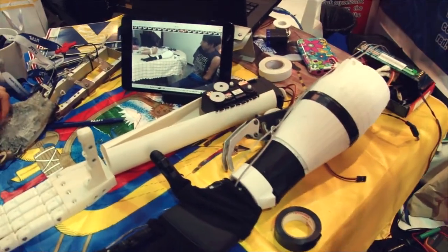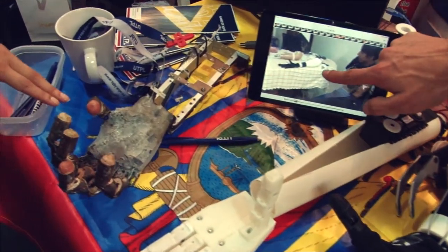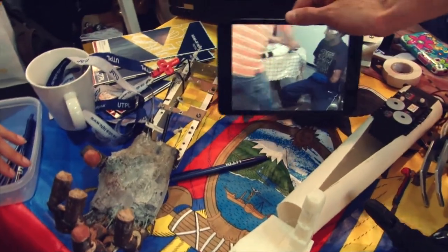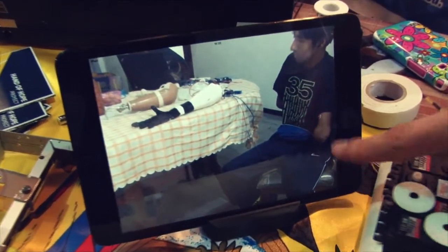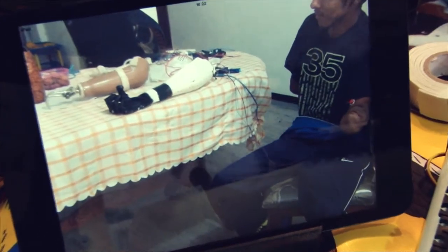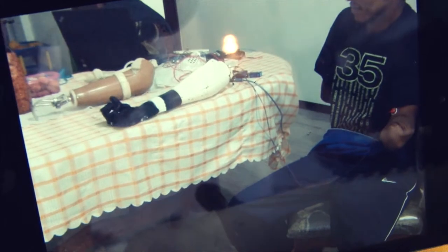This prototype is controlled by a muscular sensor and myoelectric signals. This video shows the control of the muscular sensor moving the prosthetic, and this movement is calibrated.